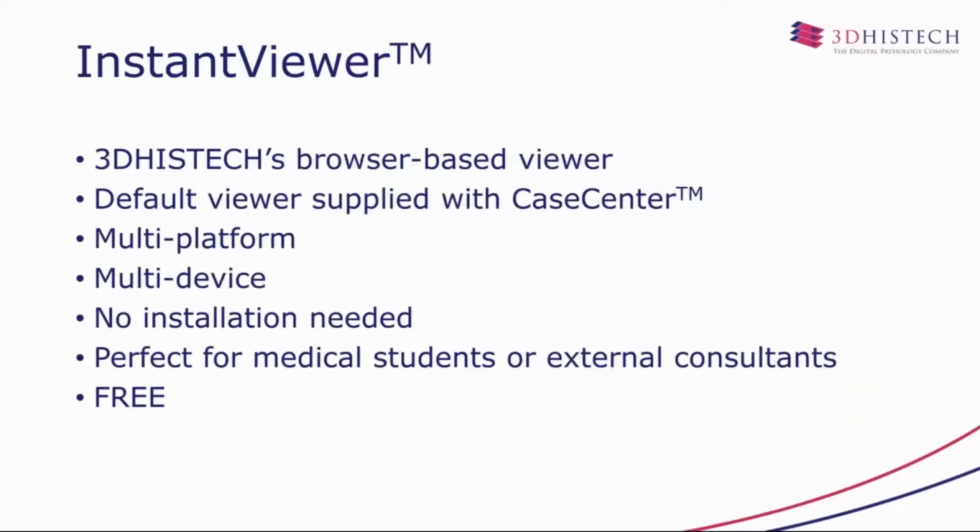The first one that I would like to show you is our instant viewer. This viewer lives in the browser. So basically, you don't need to install anything. If you have our Case Center server solution for storing digital slides, this is the default viewer there. And if you click on a slide, the slide is opened automatically in the browser by our instant viewer. Basically, you can use this viewer on any device with a decent internet browser.